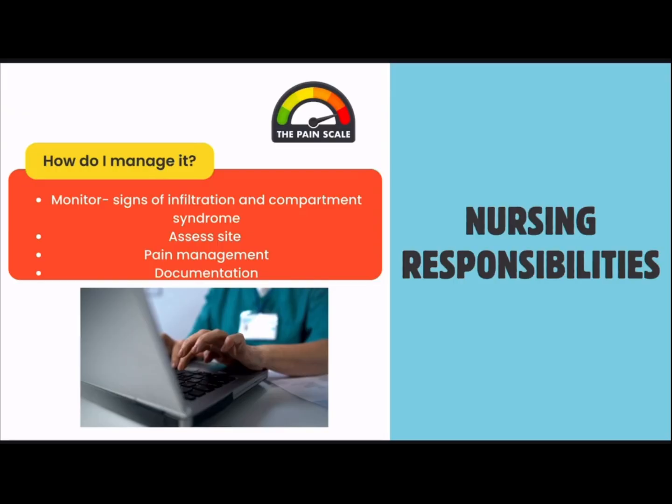And lastly, we're going to document. Just like anything we do in nursing, we really need to make sure that we're documenting really thoroughly the size, site, how it looks afterwards, if we're infusing things through it, and any complications that we notice.